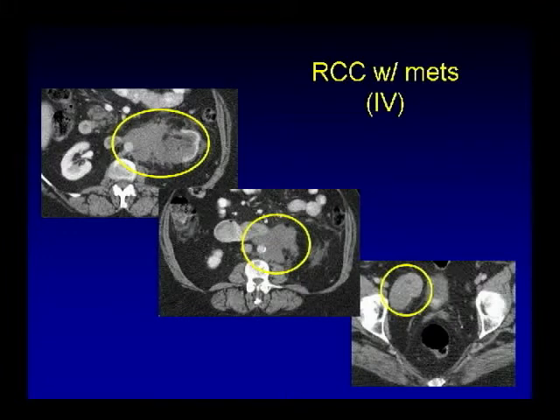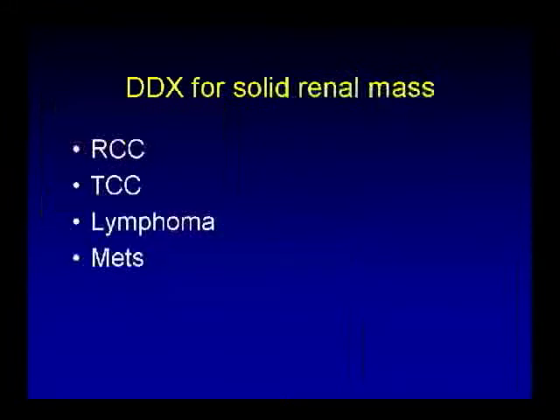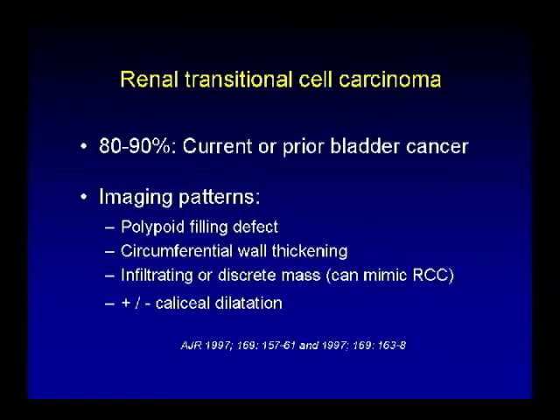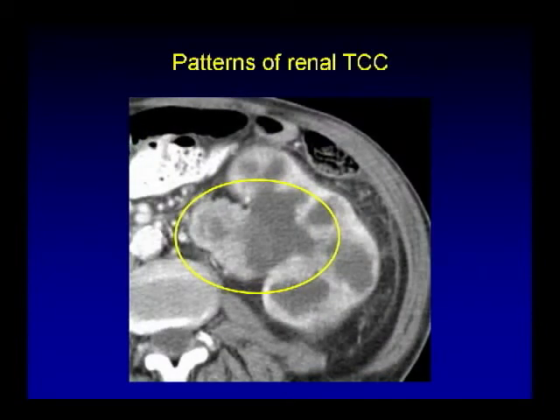Always look for other findings when you diagnose a renal cell carcinoma. The differential diagnosis for a solid renal mass without obvious fat includes renal cell carcinoma, renal transitional cell carcinoma, lymphoma, or metastasis. Renal transitional cell carcinomas most frequently occur in patients with current or prior bladder cancer. Imaging patterns include polypoid filling defects, circumferential wall thickening, infiltrating or discrete mass which can mimic RCC, and frequently caliceal dilatation. Here's an example with nodular enhancing mass in the renal pelvis and caliceal dilatation — typical of renal TCC.